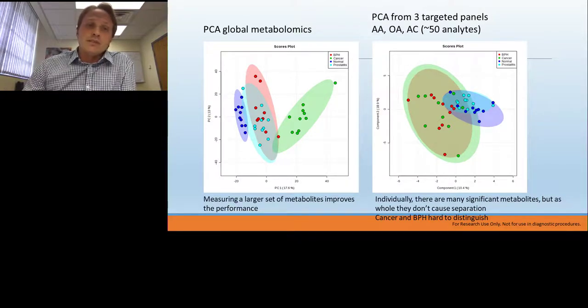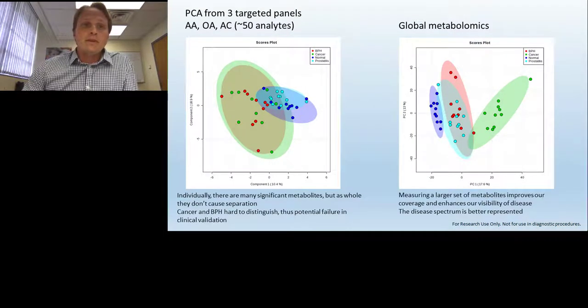And ideally, measuring clinical samples should measure the clinical scope or clinical manifestations of a disorder, not just between cancer, but between other disorders that might be present. So you have a test that might improve the quantitative performance. And so if we use a profiling approach, we can capture more metabolites and get a better idea of those that might separate our disorders of interest rather than just looking at a smaller quantitative set. And this just shows you that in the same example.